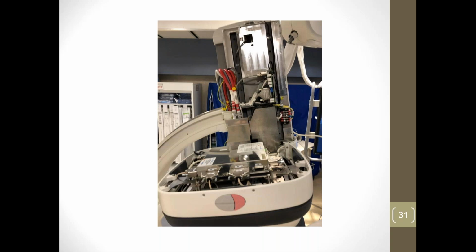These little guys, the 20 centimeter ones, are designed like a sports car version of a cath lab, because the cardiologists like to get into really tight, close angles to the patient. If you had that big 40 centimeter detector on the end, you'd be smacking the cardiologist and the patient. So that's why there are different sizes.